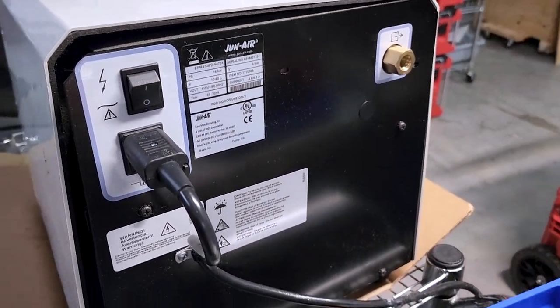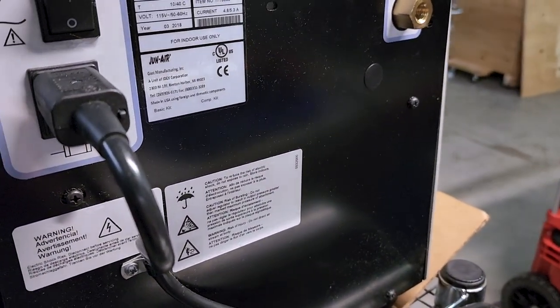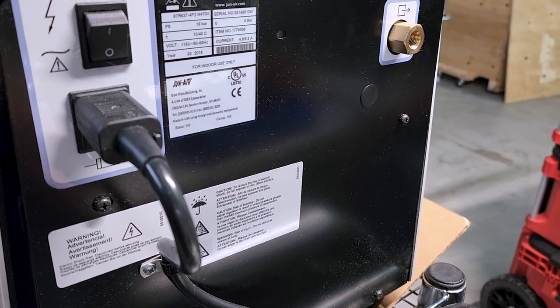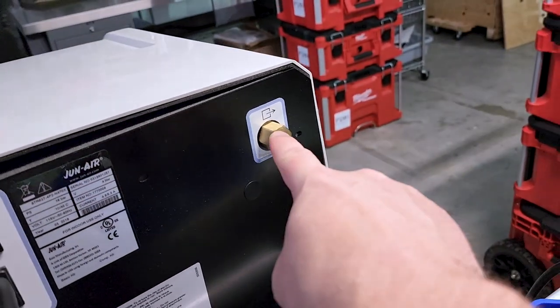You've got your main power switch. You have your IEC for 115 volt, and these guys only pull just a few amps, really. Yeah, 4.8 amps right there. And that is your pressure output.